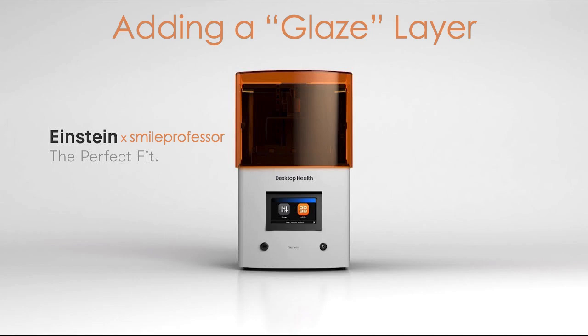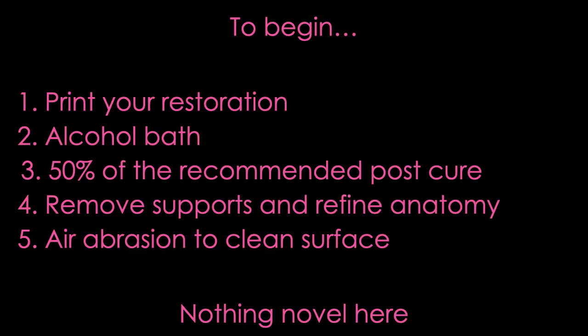Hey everyone, Tony Menito here. I just wanted to take a few minutes to talk about how to add a really nice, polished glaze layer onto your restorations. I know there's been a lot of these types of videos out there — I'm going to show you my technique specifically with printing on the Einstein and the materials that you're able to use with that. So let's go ahead and get started.